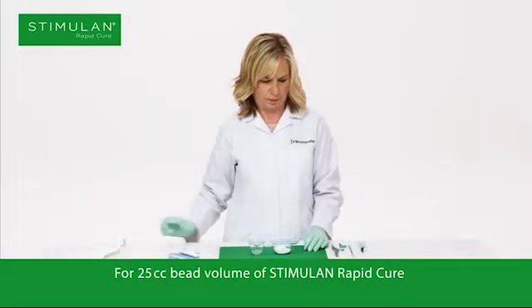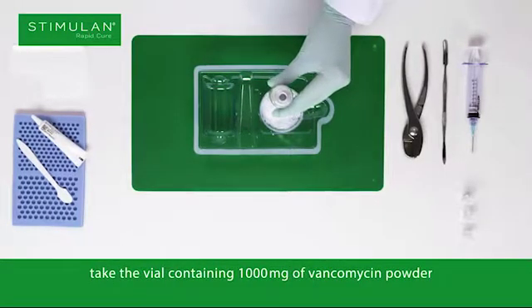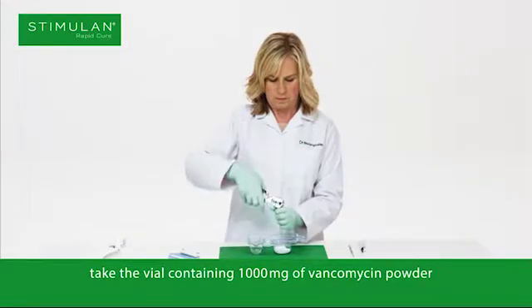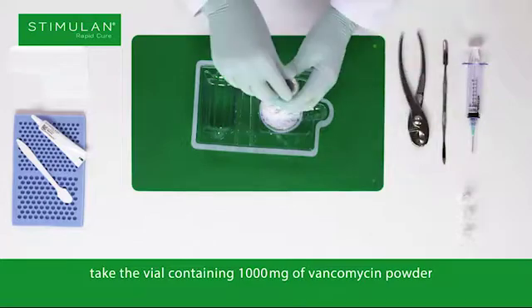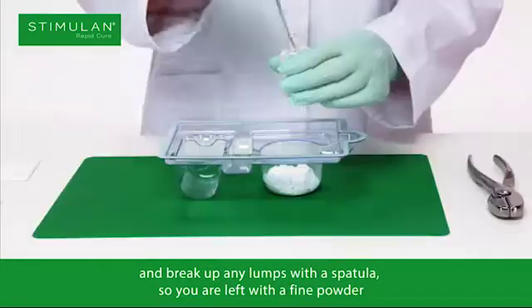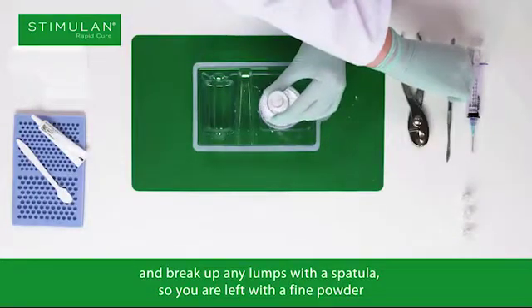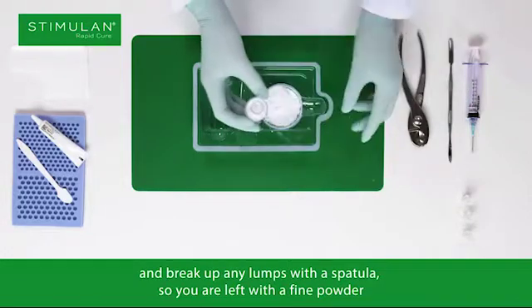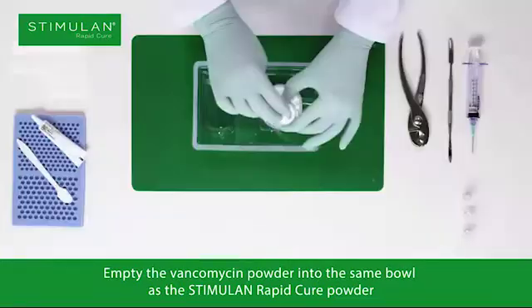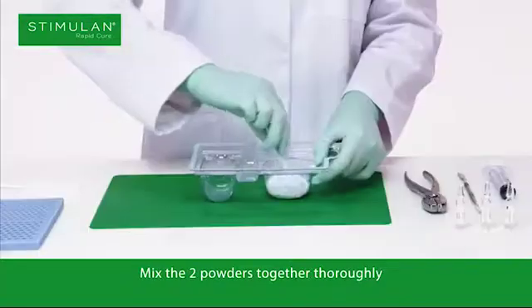For 25cc bead volume of Stimulan Rapid Cure, take the vial containing 1000mg of vancomycin powder and break up any lumps with a spatula, so you are left with a fine powder. Empty the vancomycin powder into the same bowl as the Stimulan Rapid Cure powder. Mix the two powders together thoroughly.